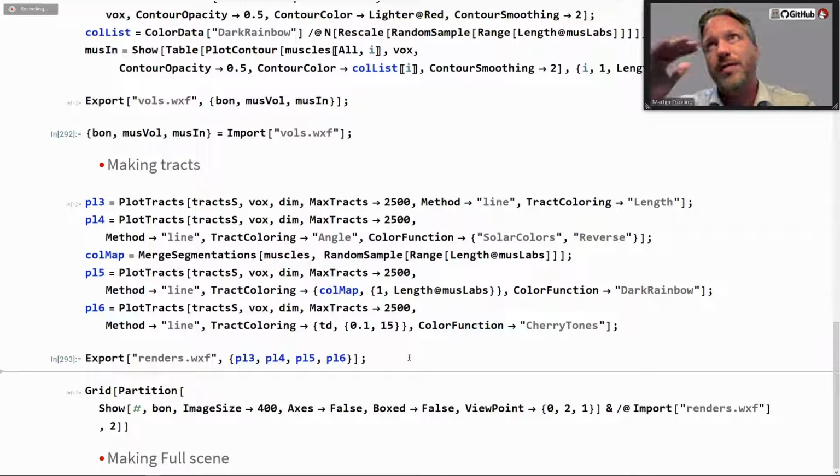So the length of the leg is, of course, 1 meter. And the resolution we're acquiring the data at is in the order of 6 by 1.5 by 1.5 millimeters. So we have typically between 1 million and 1.5 million data points in our leg where we sample everything.